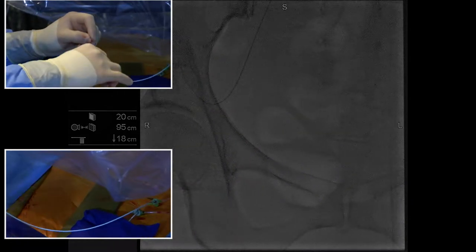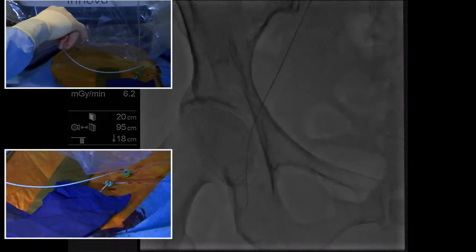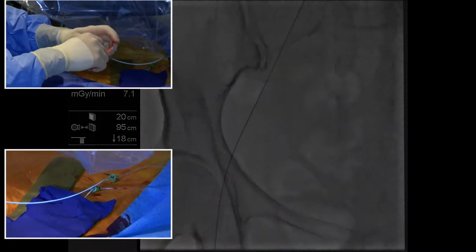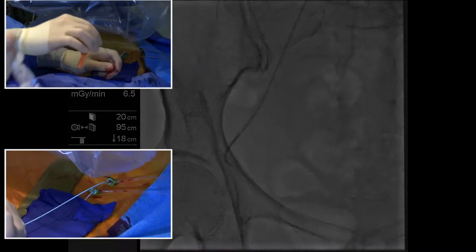And then let me get this torquer here. Can you just get, yeah, thanks. Okay. So I want my wire to go down in the common femoral like that, and then we're gonna put that down into the superficial femoral. You don't have to follow it down, it's okay. Just come back down to the, yeah, there. And now I'm gonna advance my catheter, hopefully, around the horn like that and bring it down. Okay, so now we have the catheter up and over from the other side.